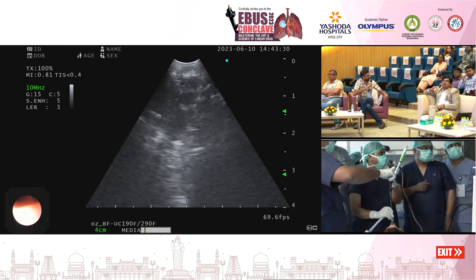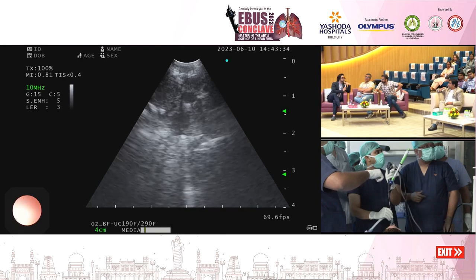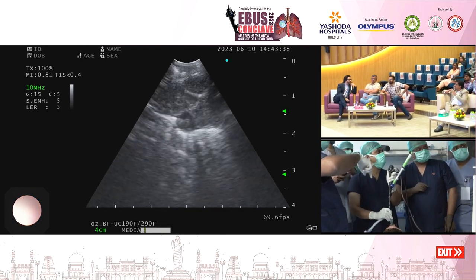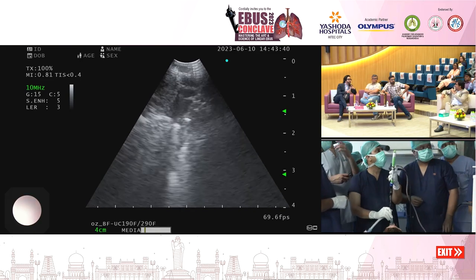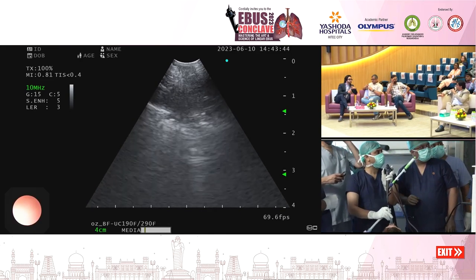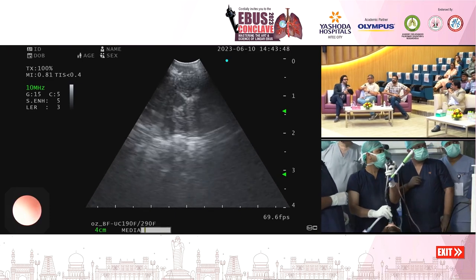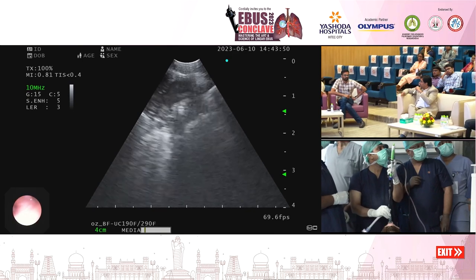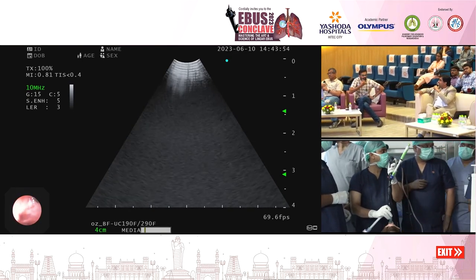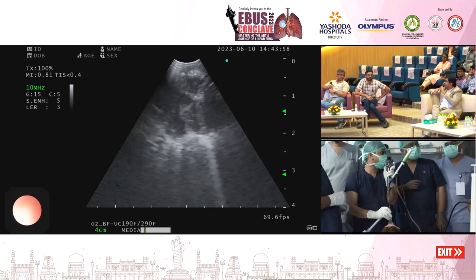Dr. Nagarjuna, do you recommend flushing of saline or using cold saline after the first sampling has been done? No. Normally we don't do anything. The bleed is very minimal and usually doesn't cause a problem even after a biopsy. In the last several biopsies we have done, only one case needed an extra technique to instill and stop the bleeding. Most of the time it is self-limited and minimal, that's all.